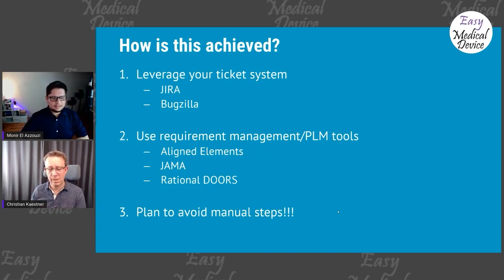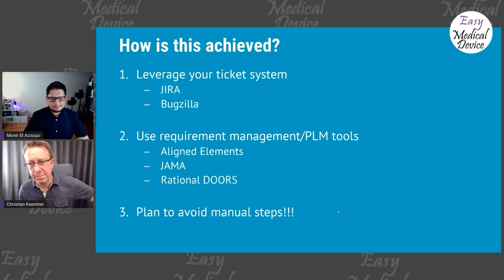Okay, so is it something that people have to be trained to use, to know when to use it, how to use it, etc.? So it's a system that you can integrate inside your development plan to make it easier to collect all the information, to act on it, and to track how you have done that, who has done that, and each version, etc. Yeah, okay.